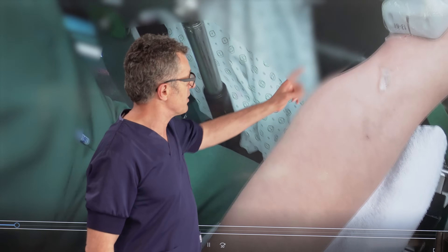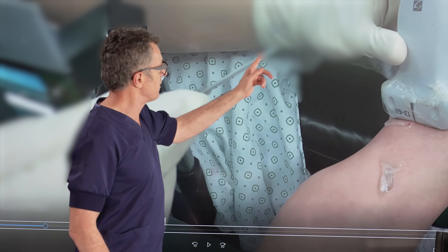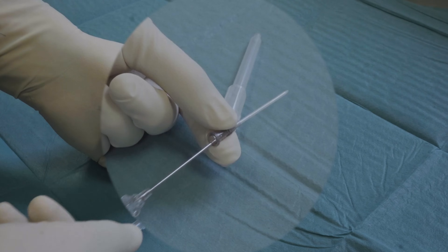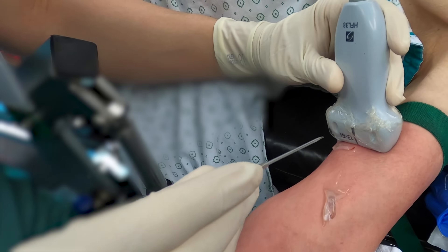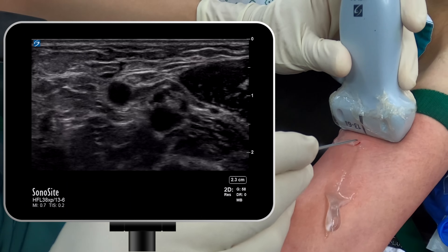We're going to use a transverse view with the ultrasound probe, and here we selected a 16-gauge catheter-over-needle system to use as an IV. The reason we're using a 16-gauge is because we're cannulating a large vein — the brachial vein — and in addition, it's easier to see on ultrasound.